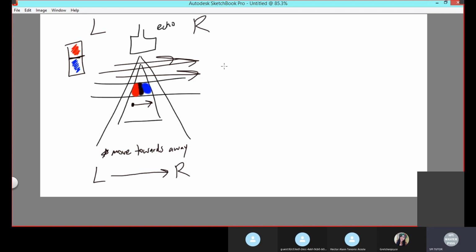In chapter 20, we talk about angles. What's going on here is that you have your color box, you have your vessel, and you have your blood moving like this from left to right, making a straight line. In the center, your beam is shooting straight down. And on the sides, your beam is shooting like this. So what you end up having is right here, you have this.